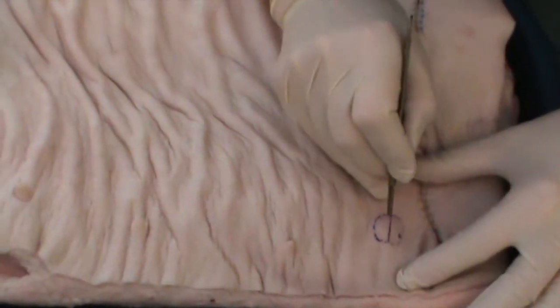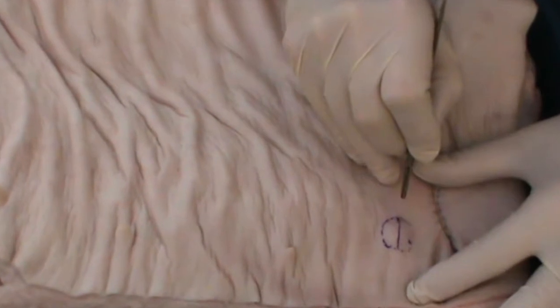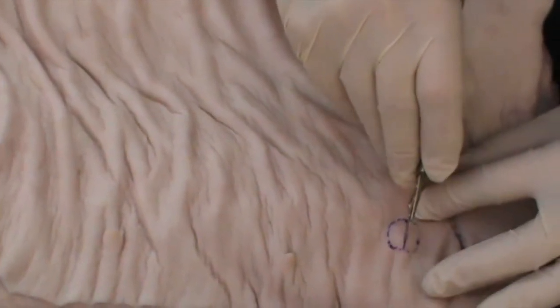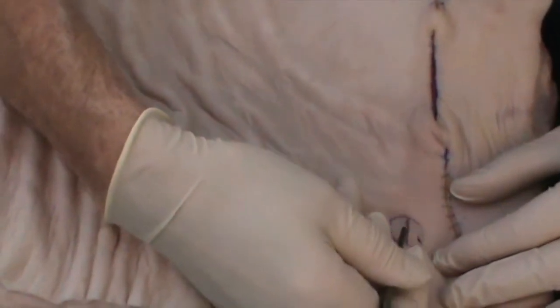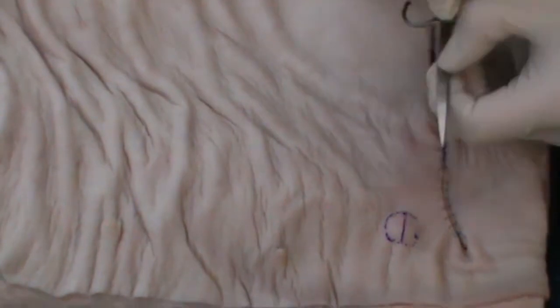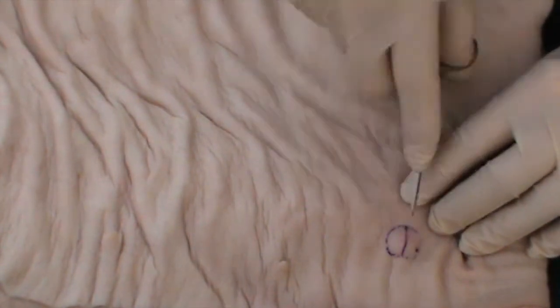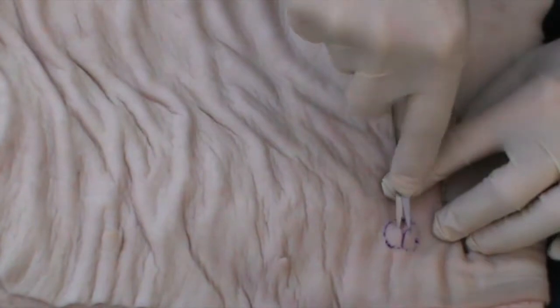Once this is anaesthetised, the idea is to take a gentle incision over the cyst. This is where time is well spent — very delicately cutting through the surface in order to avoid rupturing the cyst. I tend to do a very small amount of incising, followed by the use of fine-tipped iris scissors to gently expose the cyst wall.